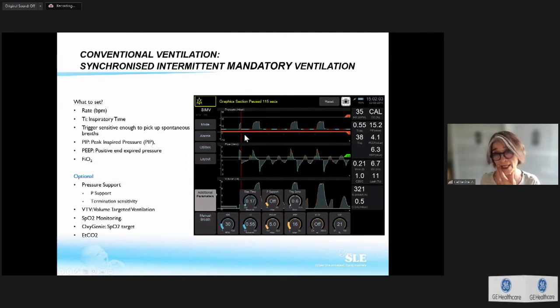So here you see your patient, you have the SIMV breath, the ventilator synchronizes with the patient. Here your patient takes a breath and the ventilator says, too early here. No, I don't push any breath. But you see your patient is taking a breath, no problem with that. And here your patient takes a new breath, and it says, okay, it's time for a new breath here. When you look here again, the patient takes a breath, the ventilator says too early. But this time the ventilator says, okay, we are not at 2 seconds, but we are coming near the time. So here I take advantage of your spontaneous breath to synchronize with you. And like that, I will have less asynchrony.